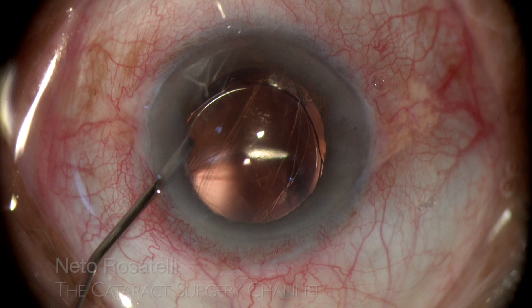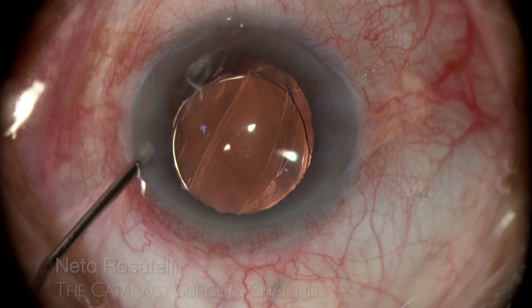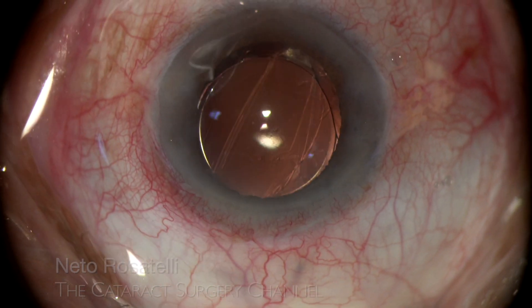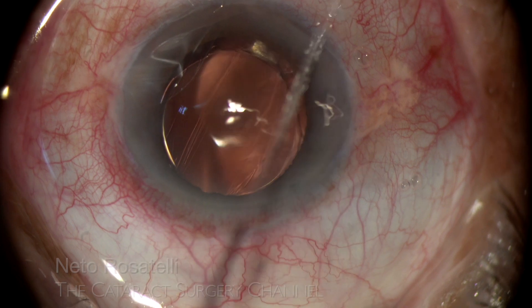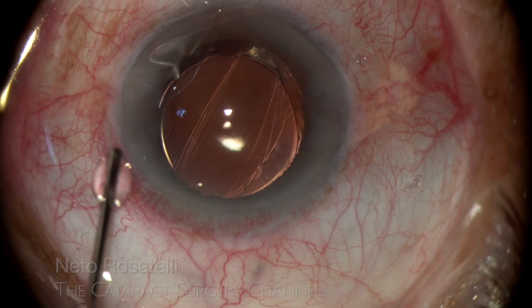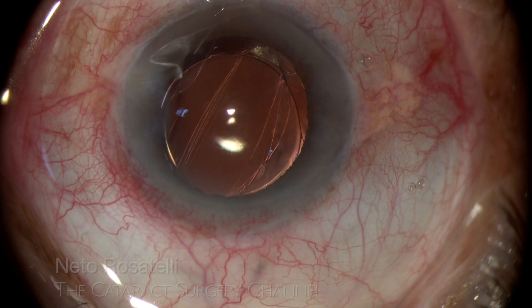A final BSS anterior chamber lavage is done to evacuate the remaining OVD and take out the carbacol in order to avoid systemic effects. The eye is pressurized and things are looking good.